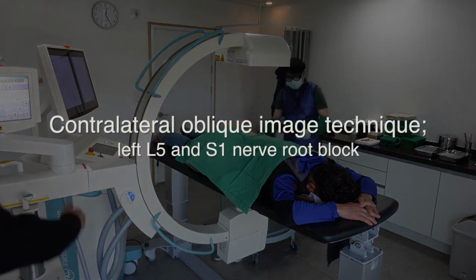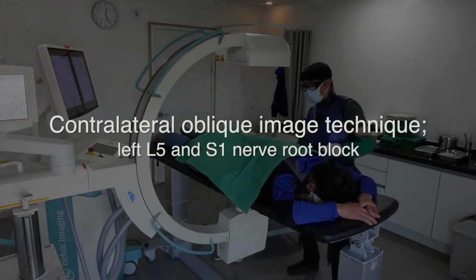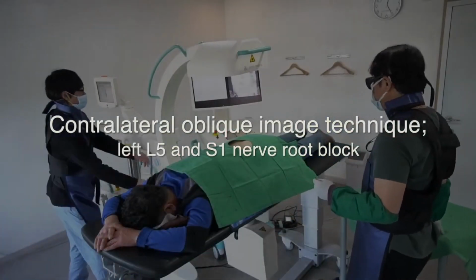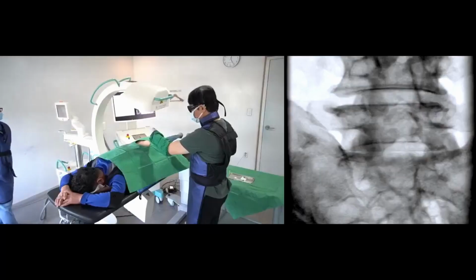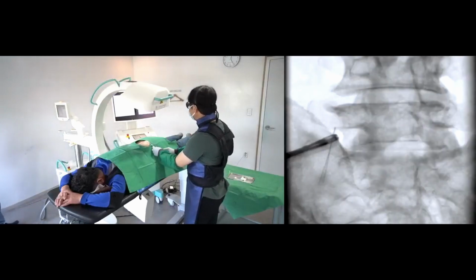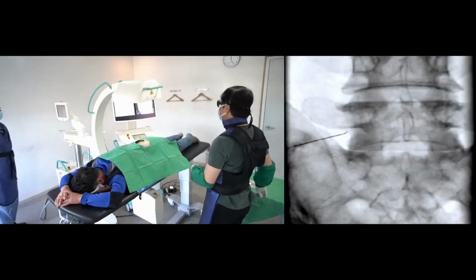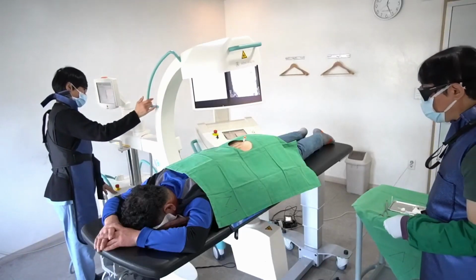L5 and S1 nerve root block technique using ipsilateral oblique, AP, and contralateral oblique C-arm image guidance. Initially, I'll introduce the needle guided by the ipsilateral oblique image. Following this, I'll rotate the C-arm to the AP view. These two different angles of stereo views allow me to estimate the needle's depth and position.